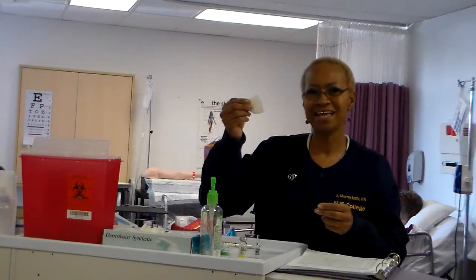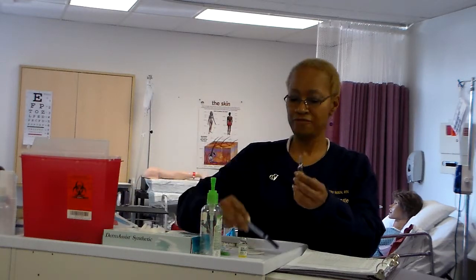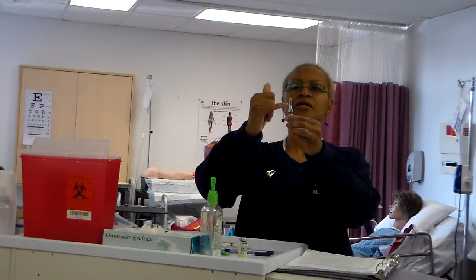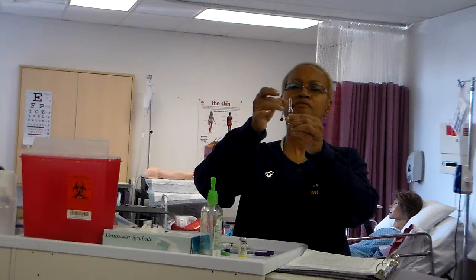Now what you're going to do is get a gauze. What am I going to tap with? I'll use my ink pen, or you can use your finger. Whether you tap it this way, the medication that's in the top of the ampule will go down, or you can use your pen and lightly tap. Either one that you want, so that all your medication is down in the actual ampule.